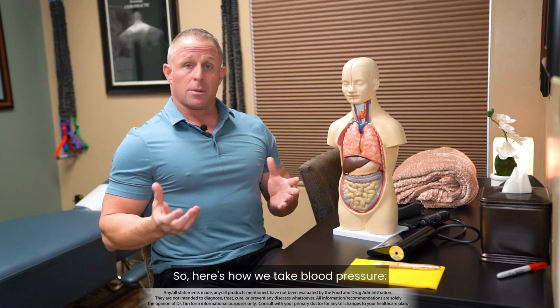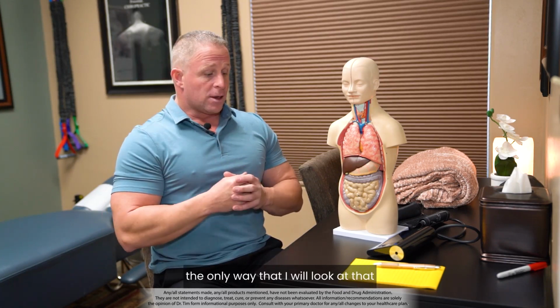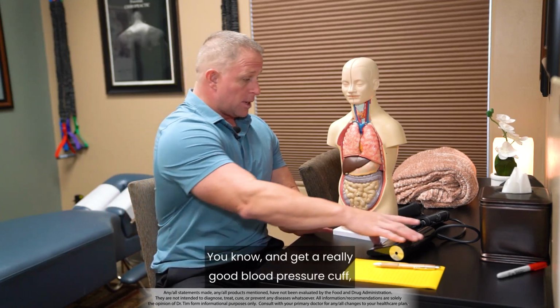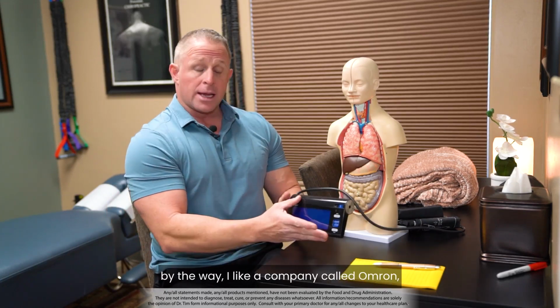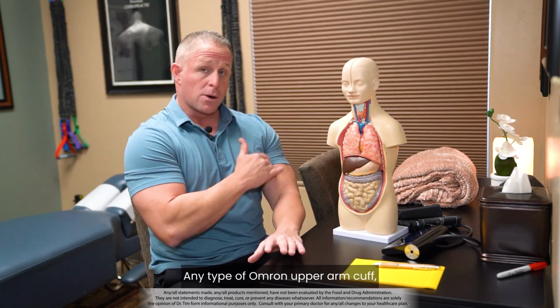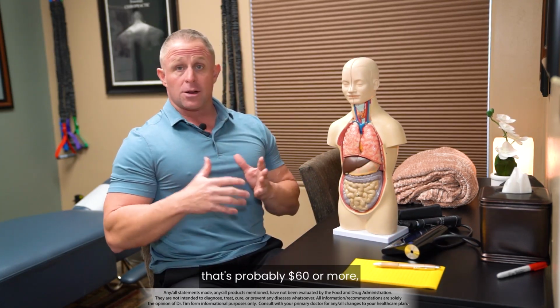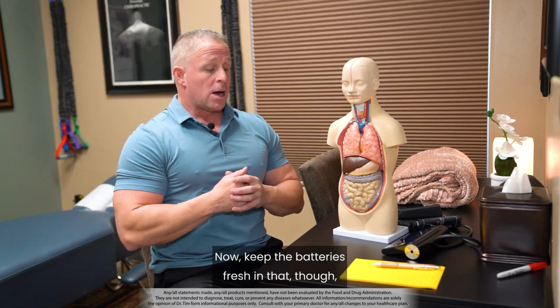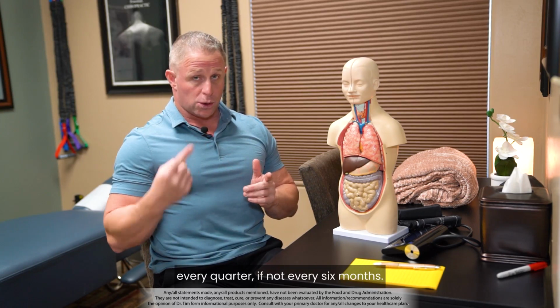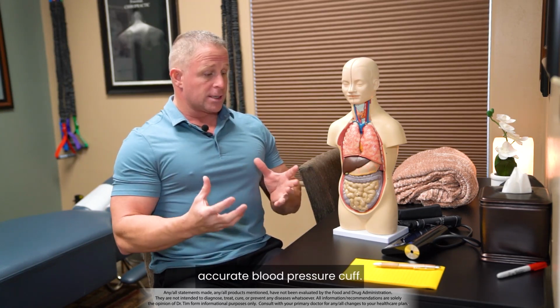So here's how we take blood pressure. That resting pressure of 80, the only way that I will look at that is if we take 9 different measurements, okay? And get a really good blood pressure cuff, by the way. I like a company called Omron. You can get those on Amazon. Any type of Omron upper arm cuff that's probably $60 or more is gonna be sufficient. Now, keep the batteries fresh in that though. I would actually change the batteries out every quarter, if not every 6 months, okay? So we want a nice, fresh, accurate blood pressure cuff.